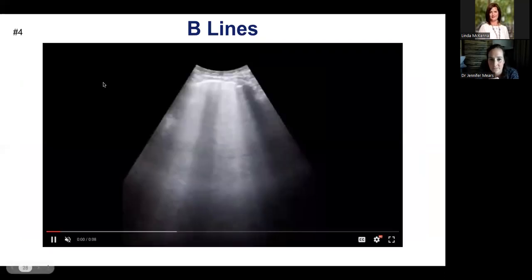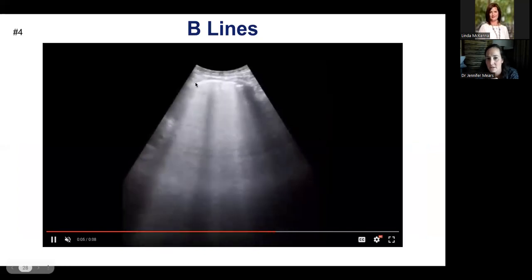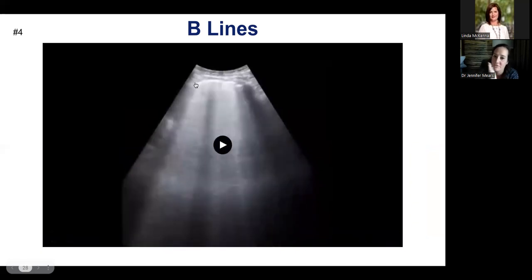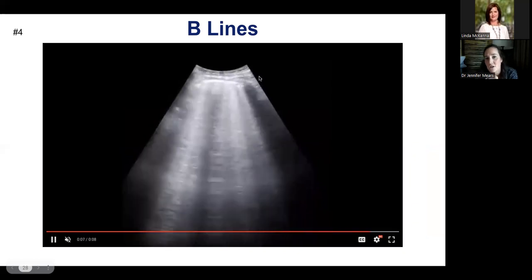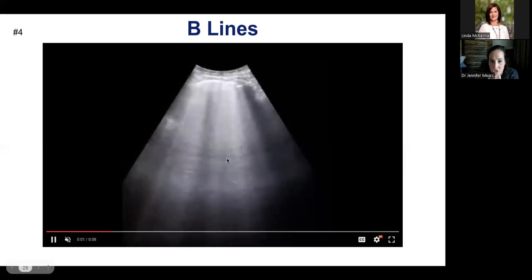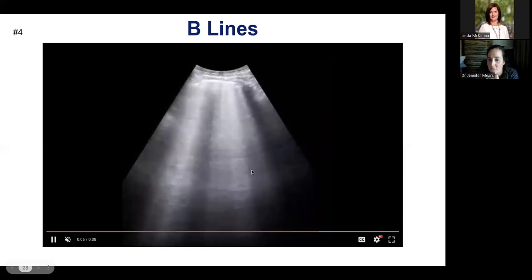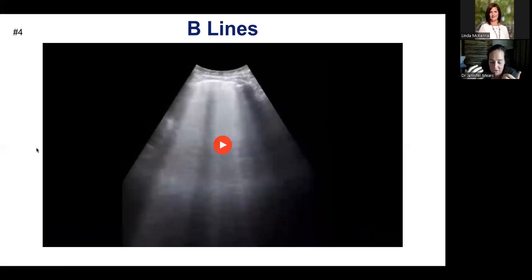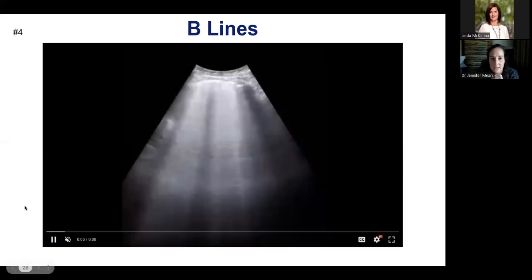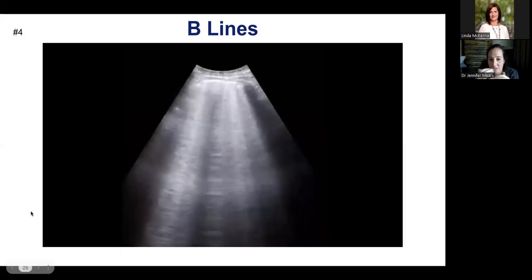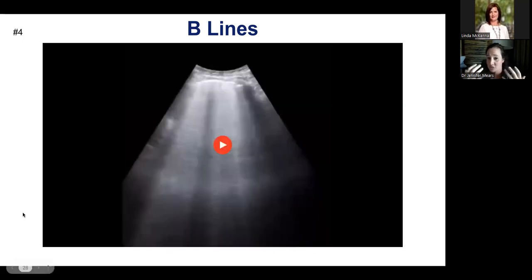This is an example of B lines. The pleural lining is a hyperechoic line signified by the visceral and parietal pleura rubbing against each other with every respiration, producing a shimmering or sliding sensation. B lines are bright jets of white hyperechoic lines coming down from the pleural line — they signify interstitial fluid having a higher frequency of ultrasound waves being reverberated back to the probe. Normal lungs only have A lines, but interstitial fluid projects these B lines from the pleural lining. B lines can be seen unilaterally with pneumonia or with generalized interstitial fluid if someone is volume overloaded.